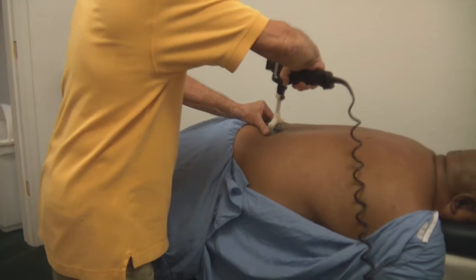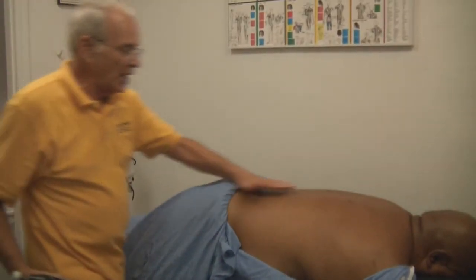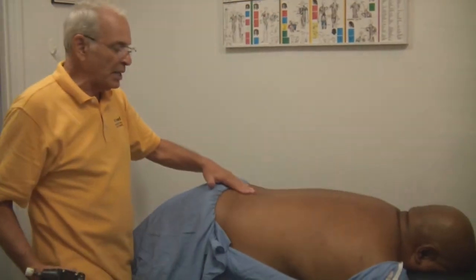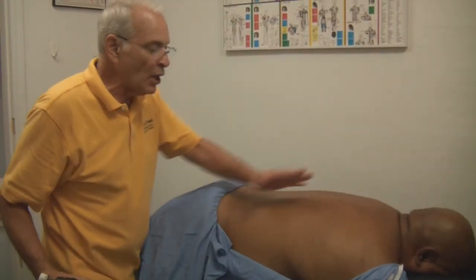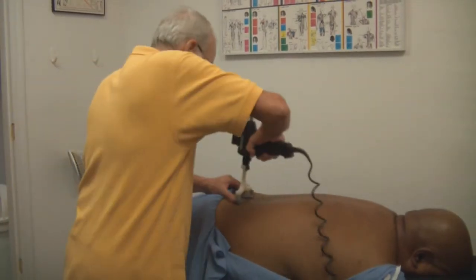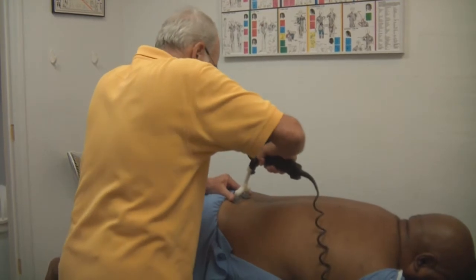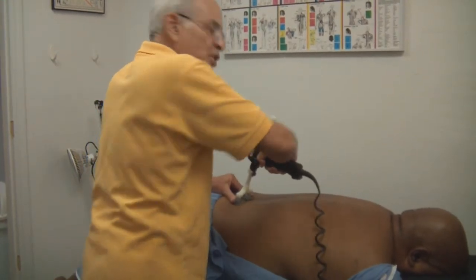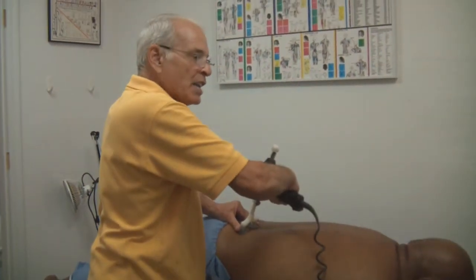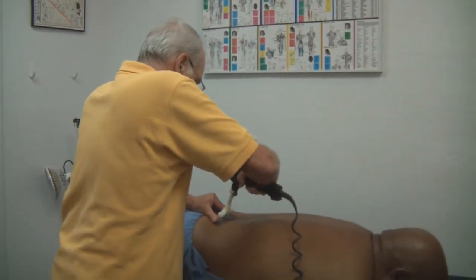So we're putting motion in while we are adjusting. He is on a skew, as you can see. This straightens the spine completely and the hips. Even though the table is not correct, this is correct for the hip. So if we adjust him in this position, we have a much greater opportunity to make a difference because we're unjamming the system. Think about it — the system has been jammed. How does this feel, sir? It feels great, sir.